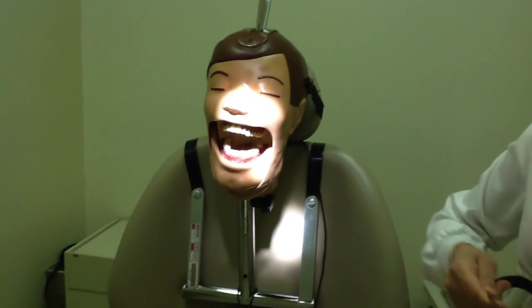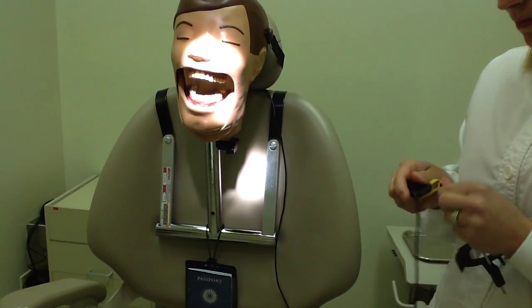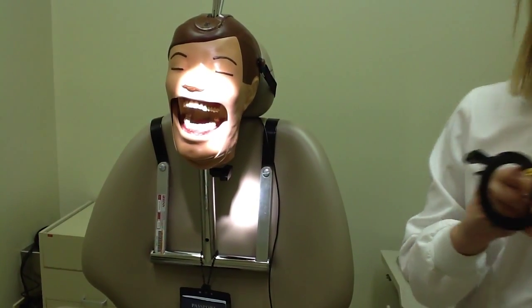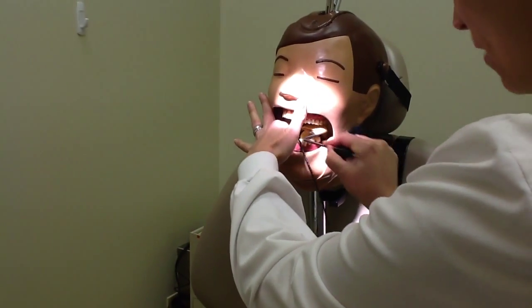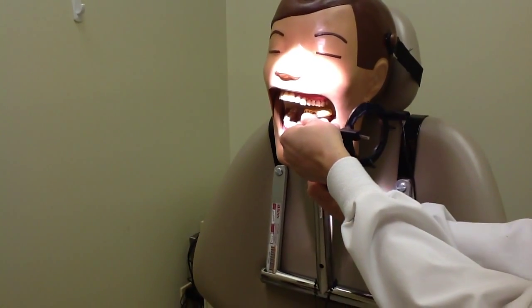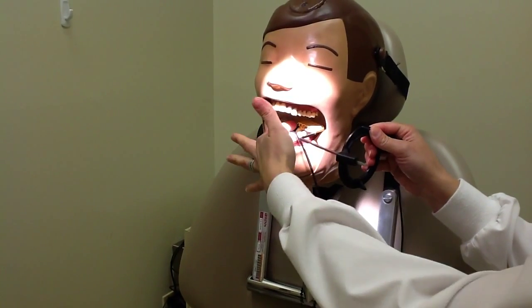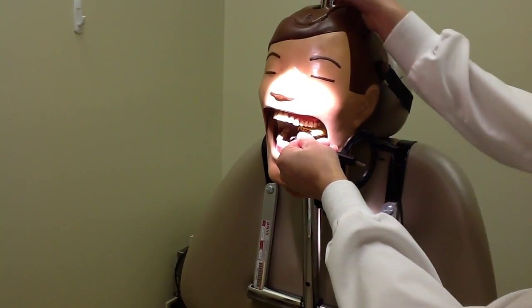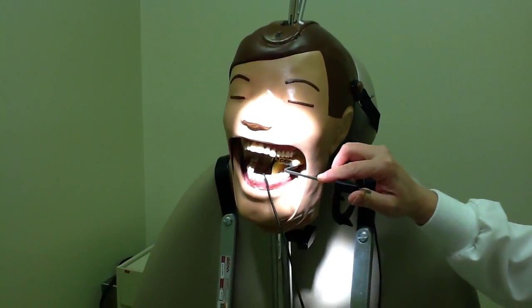Okay, so I'm just going to readjust my XCP kit, and we're going to continue in positioning. We're going to bring our receptor in and line it up. We want it centered. So if the dentist's requisition is for a 3/6, we're going to center our 3/6 on our receptor, and make sure that it's parallel to the long axis of the tooth and centered there. Before I have the patient close, I want to make a two-point contact, or what we call seat the receptor.